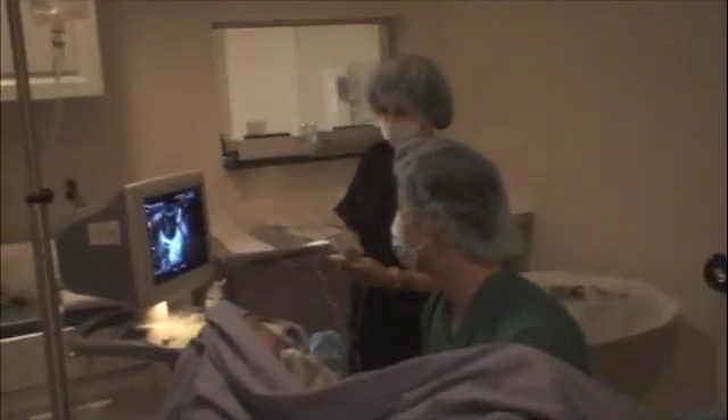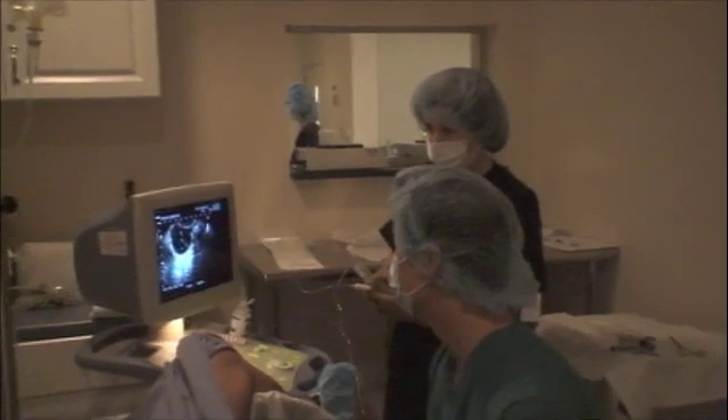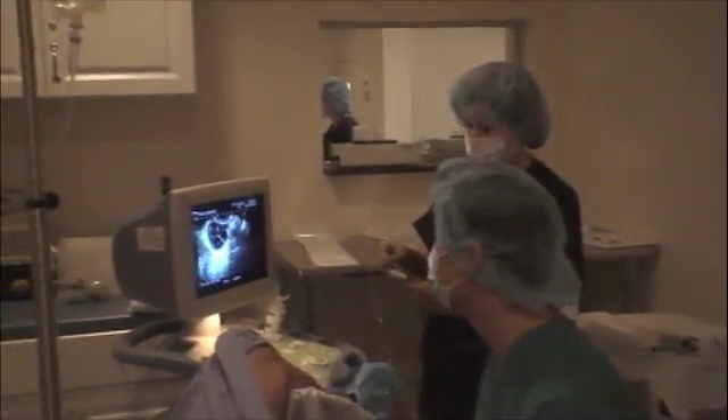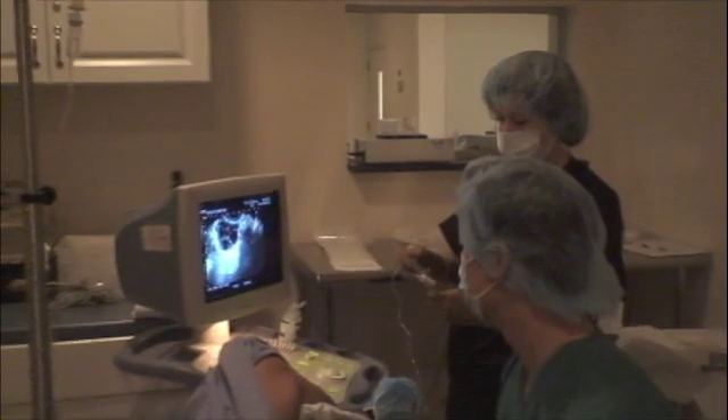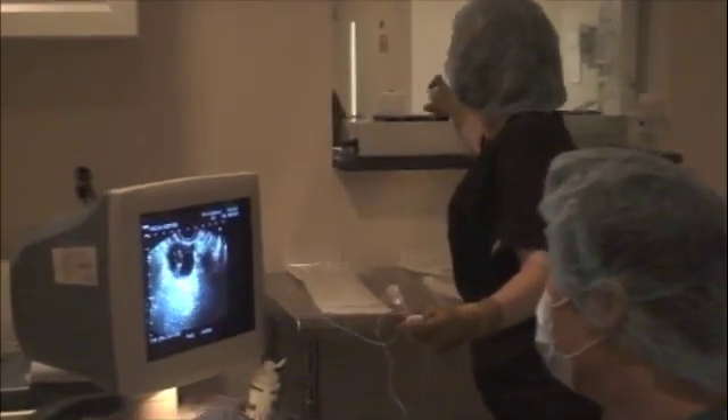We perform the egg retrievals in a procedure room that's adjacent to the IVF lab, which you can see here on the other side of the window. The patient is currently under anesthesia, and we have an anesthetist that administers IV sedation for this.